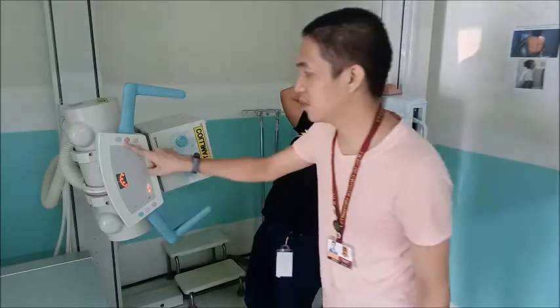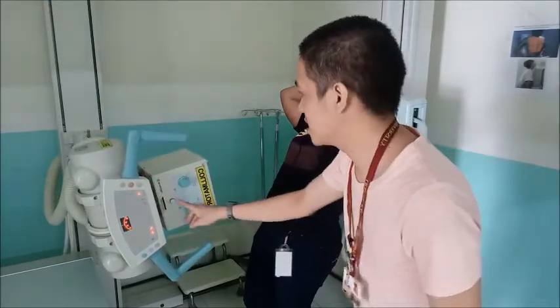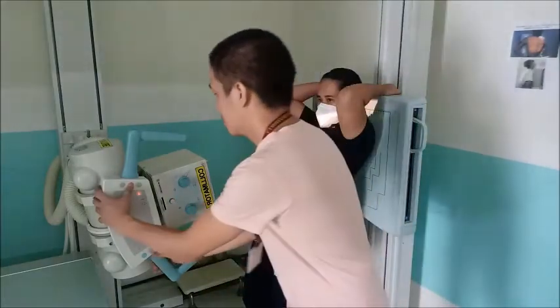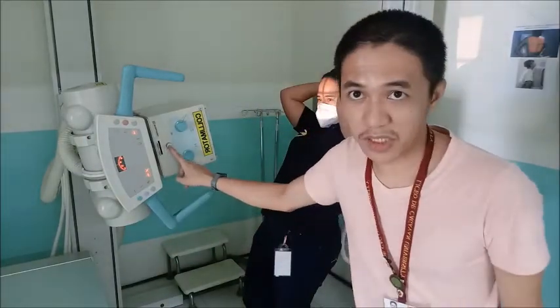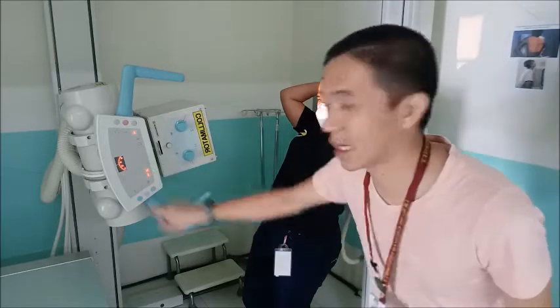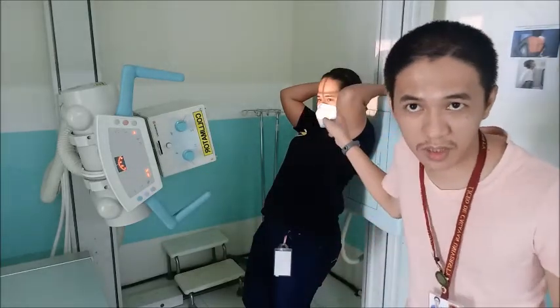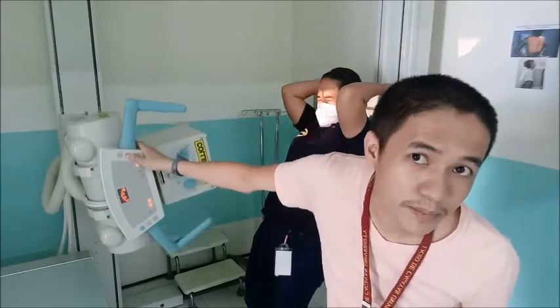Of course, I need to adjust. Dili nga imo lang isipalad pero wala nimo siya ginaog, so wala pulos imuhang sipalad angulation. For example, gisipalad nimo nakaana, sakto lagi mo angulation, naka 15 degrees, pero yung mga target is na sa ulo. Diba? Walay pulos yung mga examination.